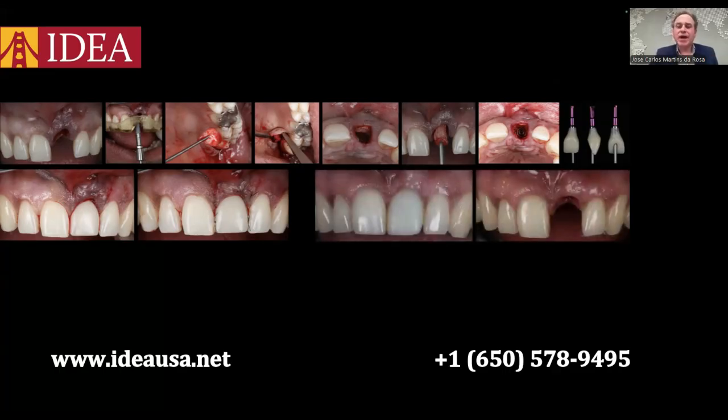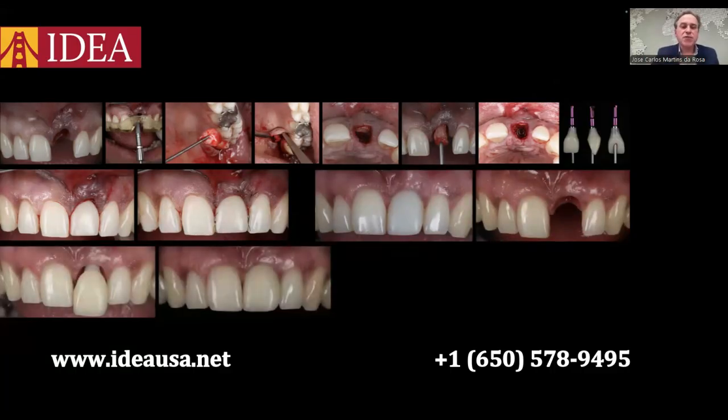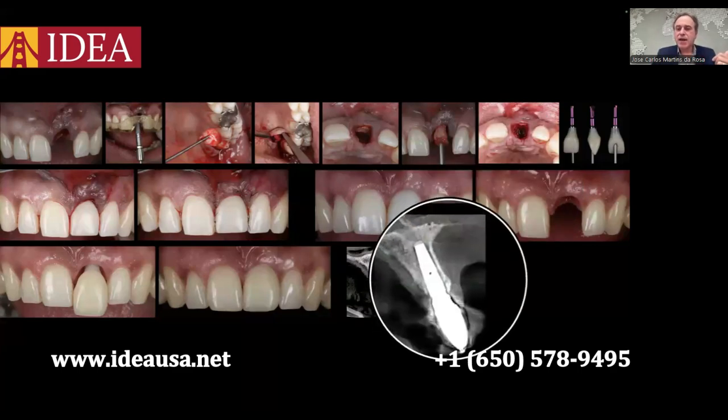After 3 months, we have the soft and hard tissues completely healed. What we did? We did the scanning, and we delivered the final restoration, a porcelain restoration with ideal emergence profile. And you see here the CBCT scan before and after we delivered the final restoration. The buccal wall was back, the palatal wall was back. So we have the bone completely remodeled and is still stable around this implant.